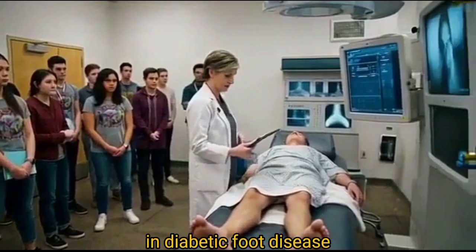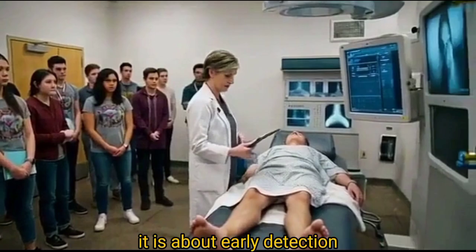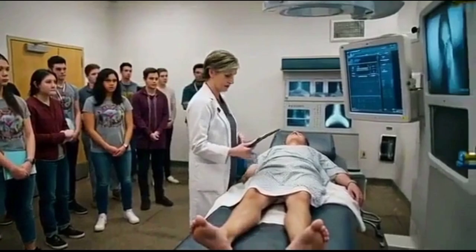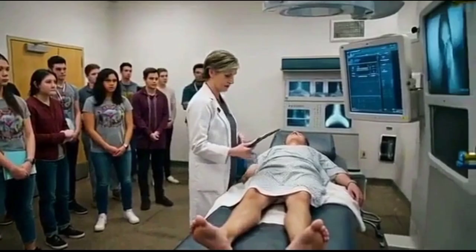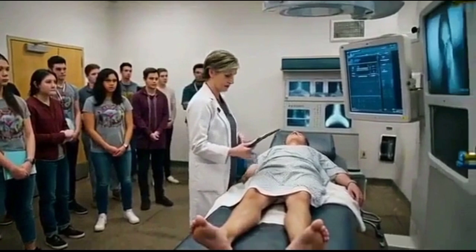In diabetic foot disease, radiography is not about dramatic findings. It is about early detection. Small changes that can alter treatment pathways and prevent major complications. Because in clinical imaging, timing determines outcome. Early detection may allow conservative management. Late detection may require surgical intervention or amputation.